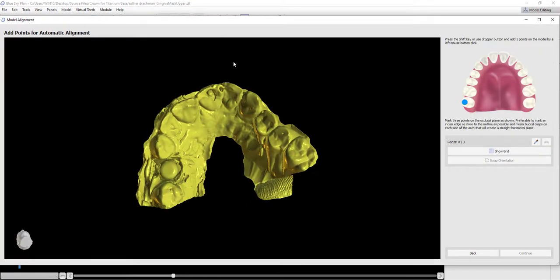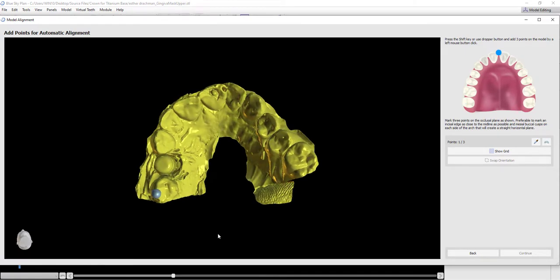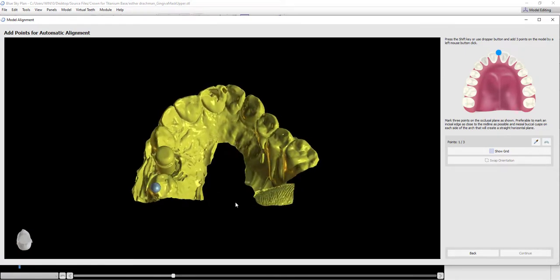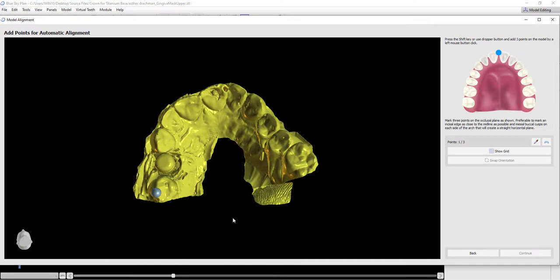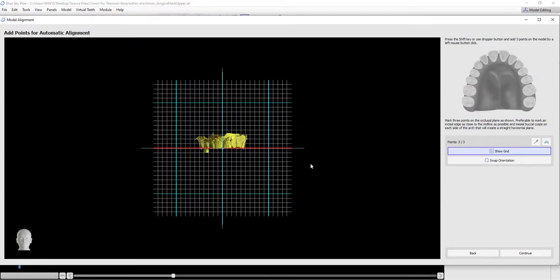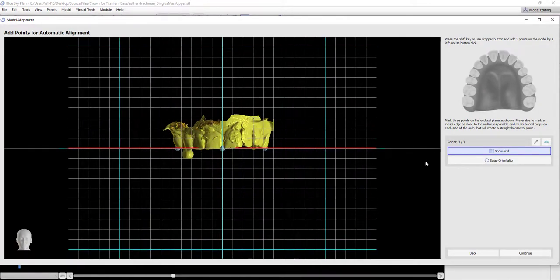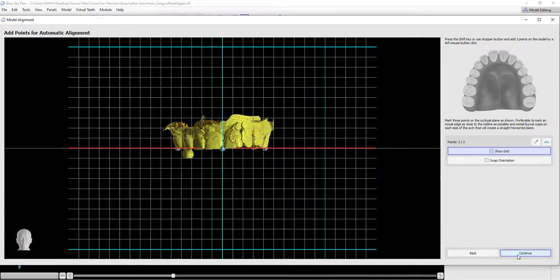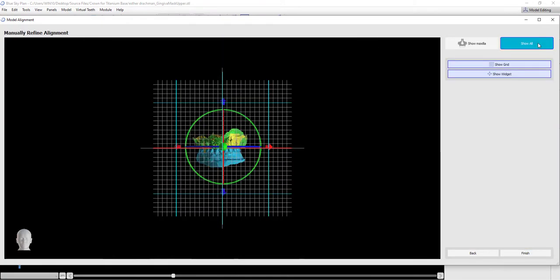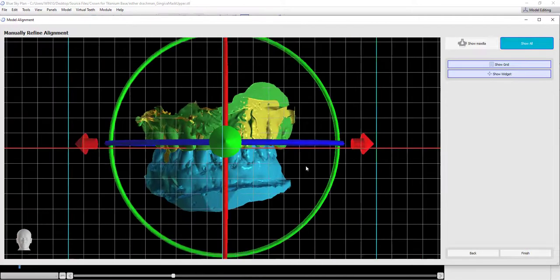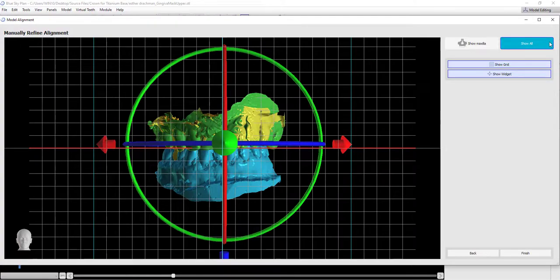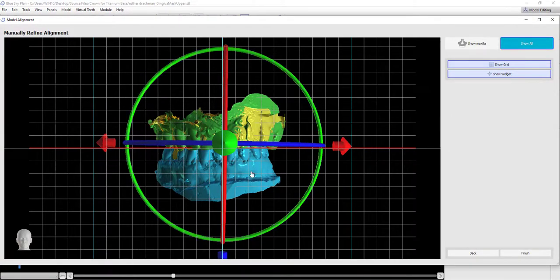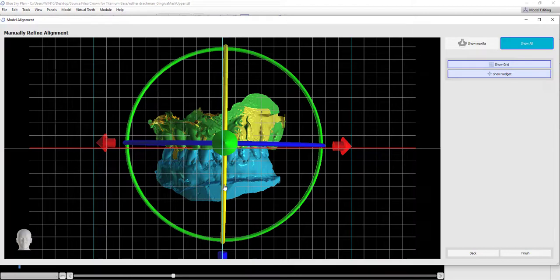We are going to mark our first point on one side of the arch, our second point as close to the midline as possible, and our third point on the opposing side of the arch. The software orients the model. I clicked Show All to show all of the relevant models, and here I can fine-tune the orientation as needed.